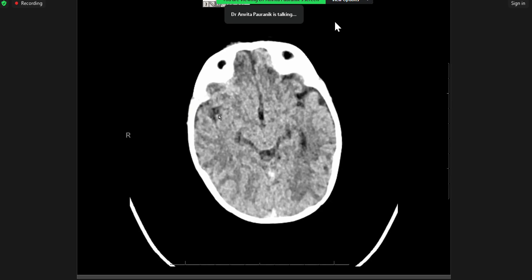Yoshi, you have mentioned follow-up scan and clinical correlation. I will probably not choose that, unfortunately, because we are the ones who should be doing the correlation, right? So we have the charts, we will have the history, and if you're worried about anything in the clinical history, we should be correlating. So if there is one take home message from today, please do not write the words advise clinical correlation. Follow up is fine. Yes, occasionally we definitely need to follow up a few things to figure out whether something is transient or not. But clinical correlation is a phrase which I will never ever put in my report.